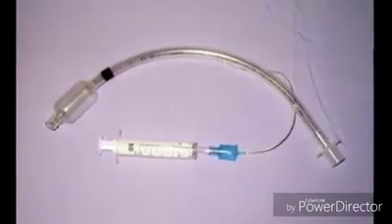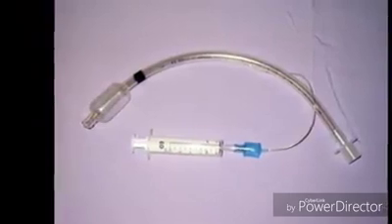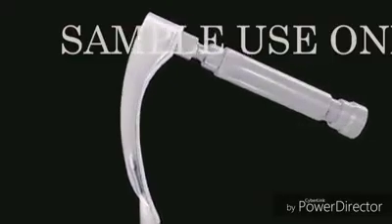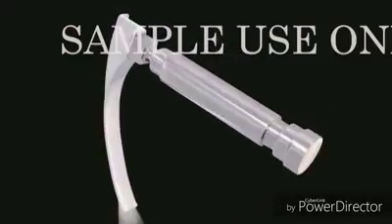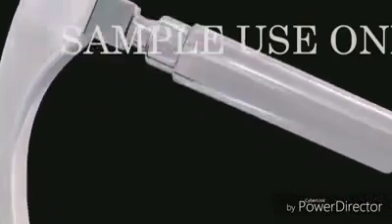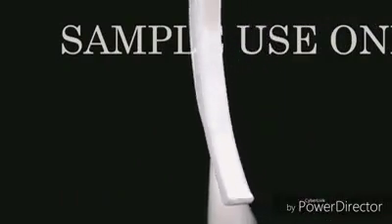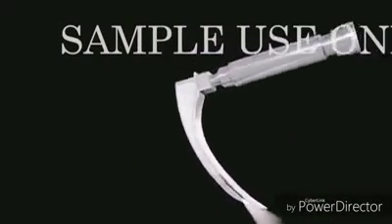To perform the process of intubation, basically two things are required. First one is the endotracheal tube and the second one is a laryngoscope. Laryngoscope has two parts. First one is the handle of the laryngoscope and the second one is the blade of the laryngoscope with a point source of light. Now we are going to start the process of intubation.